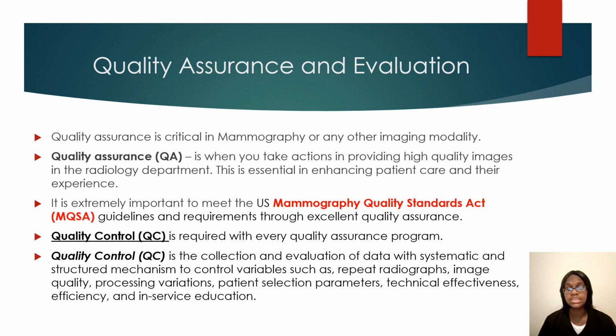Now we're going to talk about quality assurance and evaluation. QA is very critical in mammo. It is going to help provide high quality images in the mammo and radiology department. This is very helpful in enhancing the patient care experience. And with QA, you also have QC. Quality control, or QC, is the collection and evaluation of data with systematic and structured mechanisms to control variables such as repeat radiographs from tech repeats, image quality, processing variations, patient selection parameters, technical effectiveness. So this is going to test all of those so that we can implement and make corrections when needed.